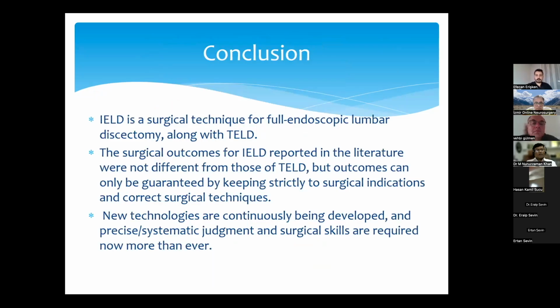So interlaminar endoscopy is a surgical technique for full endoscopic lumbar discectomy along with transforaminal surgery. The surgical outcomes for interlaminar reported in the literature are not different from those of transforaminal, but outcomes can only be guaranteed by keeping strictly to surgical indications and correct surgical techniques. New technologies are continuously being developed, and precise systemic judgment and surgical skills are required now more than ever.